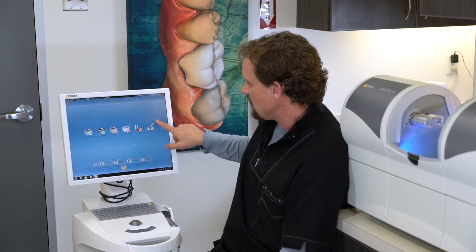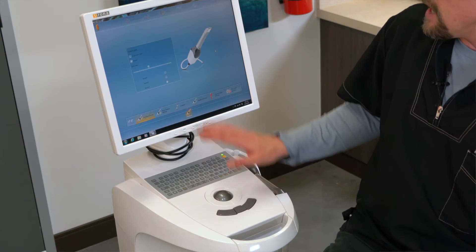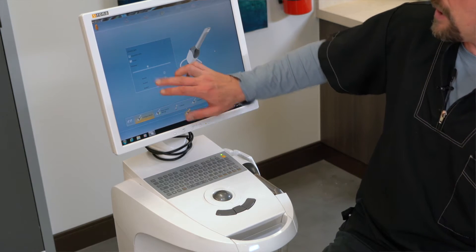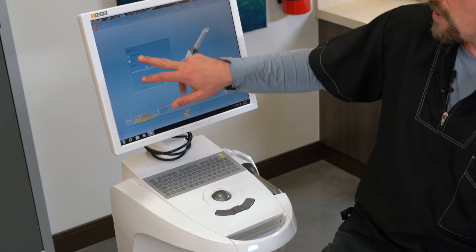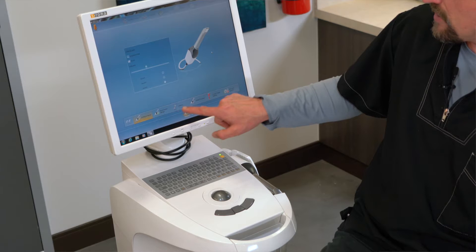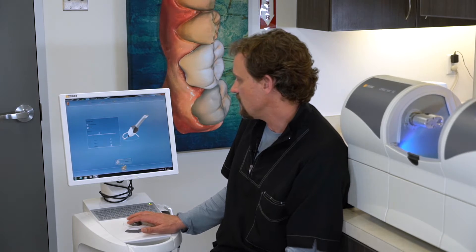We're going to calibrate the Omnicam, which is on the right-hand side. Select that. When this is selected, this is the same place that you select your sounds and the volume or acquisition hints, but we're going to go down here to this little wrench — it says calibrate. Click that on.